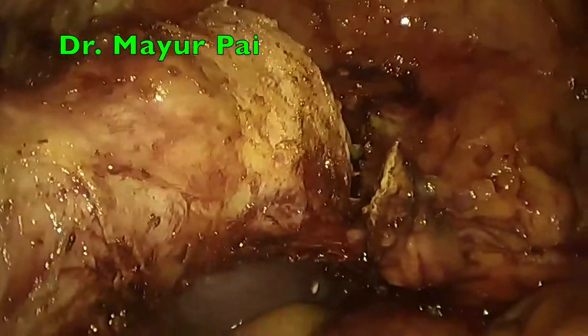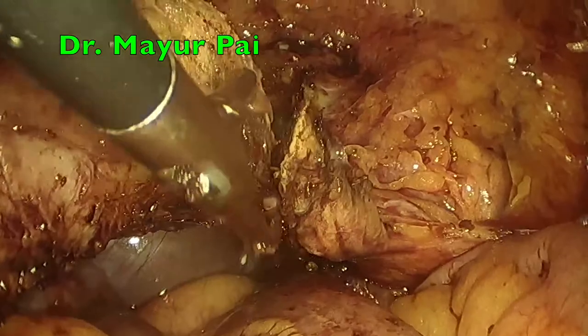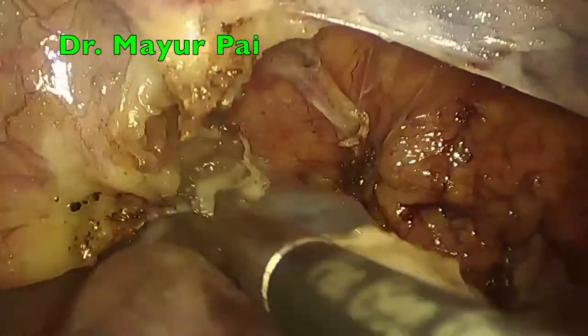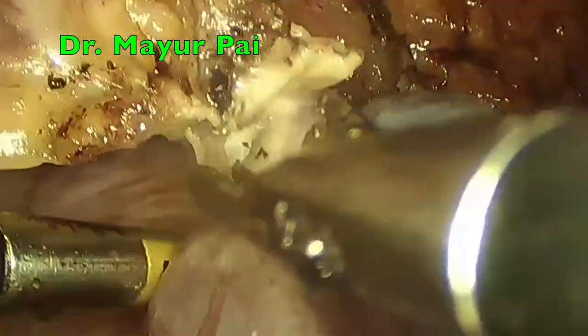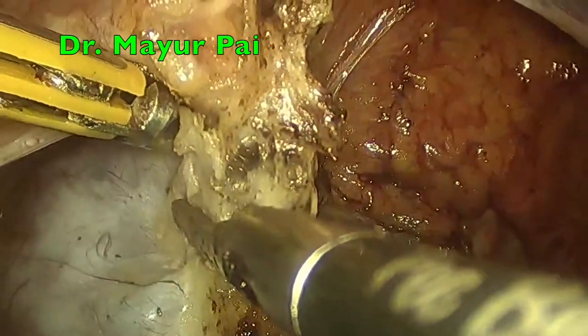Once the colpotomy is almost done and the uterus is liberated, we usually use a volsellum or a tenaculum which is put through the vagina to hold the cervix and then pull the uterus out. At the end of the case, we are removing the adnexal mass. Now this is the coagulation and cutting of the infundibulopelvic ligament.